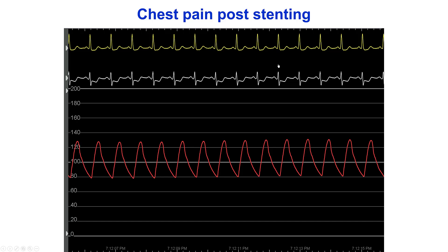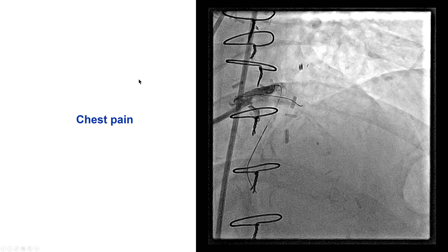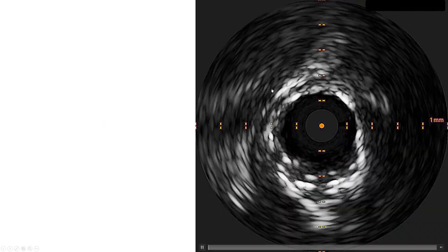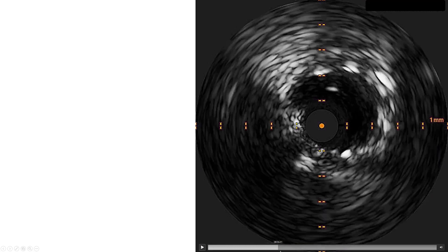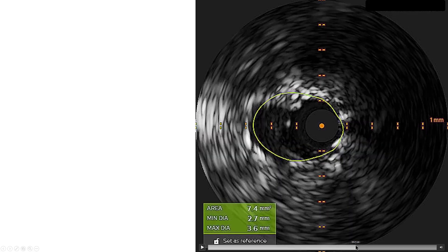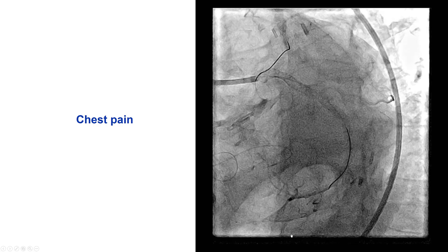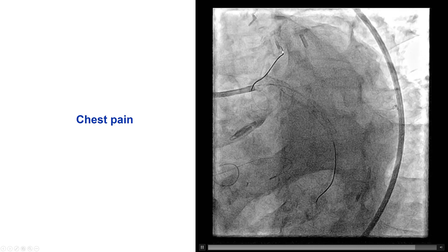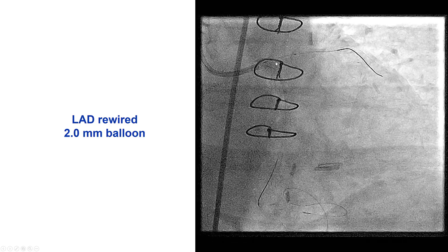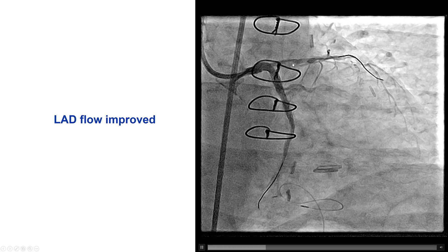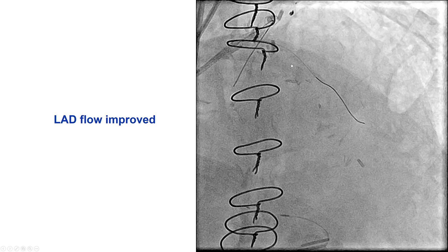However, after the stent was deployed, the patient started having significant chest pain again with ST-segment depressions worse than at the beginning. The left main appeared okay on imaging, but flow in the LAD seemed to have subsequently decreased. IVUS showed much better expansion of the left main — minimum lumen area was 8 mm². We thought the culprit was the LAD. Fortunately, we had a jailed wire — a Sion Black — into the LAD. We rewired with the Sion Blue, performed multiple inflations with a 2.0 mm balloon, and that restored TIMI flow into the LAD.